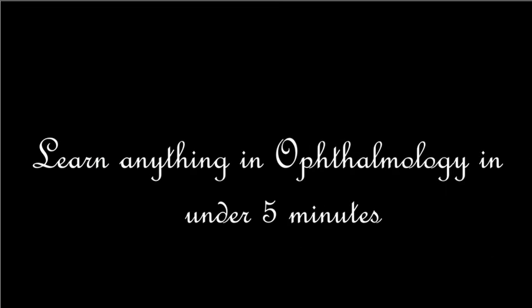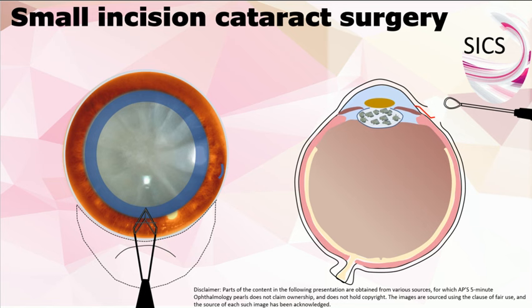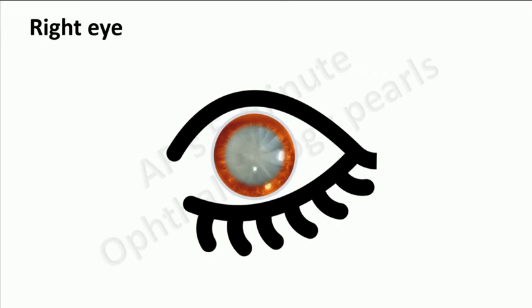Watch, understand and remember anything in ophthalmology in under 5 minutes. Today we will cover the basics of small incision cataract surgery or SICS. So first, a little bit of orientation. The surgical technique will be demonstrated with respect to the right eye.